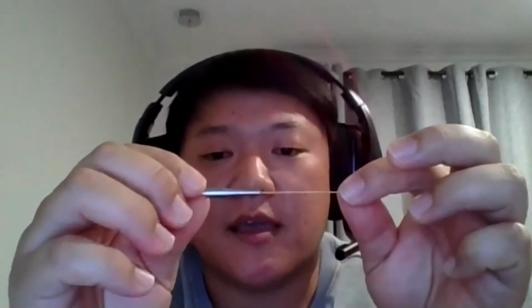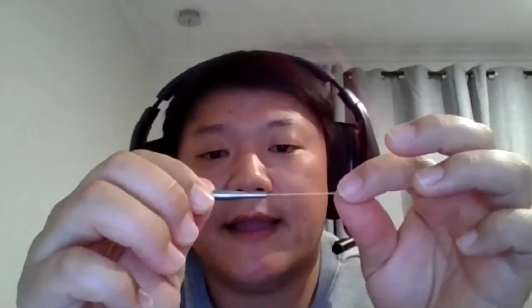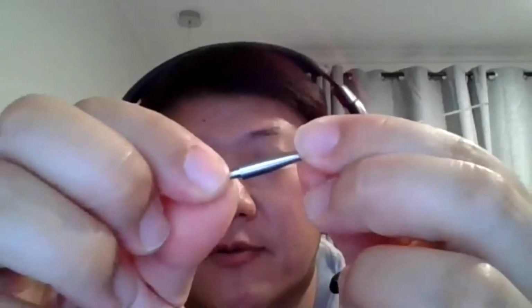With the tip itself, a couple of tips. There's a button that slides your fiber optic tip up and down. I should talk about how you load your tip as well. There are actually 2 different tips if you look. One is, I believe, 400 microns, and the other is 300. The smaller one is used for endodontic applications, and the 400 is more for general surgery. They've got a little number on the metal barrel that says 400 or 300, so you can differentiate them.